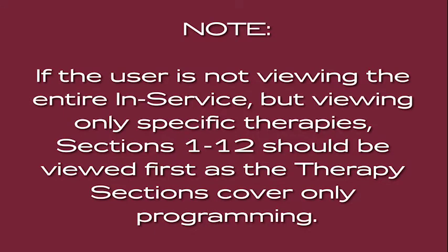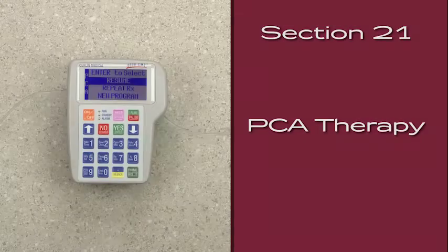If the user is not viewing the entire in-service, but viewing only specific therapies, sections 1 through 12 should be viewed first, as the therapy sections cover only programming.